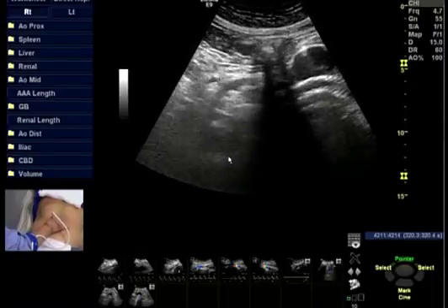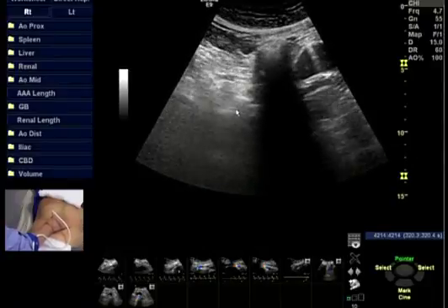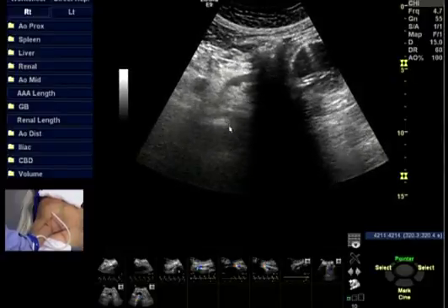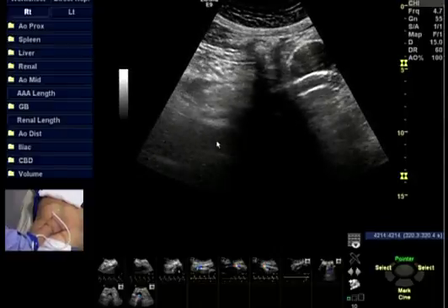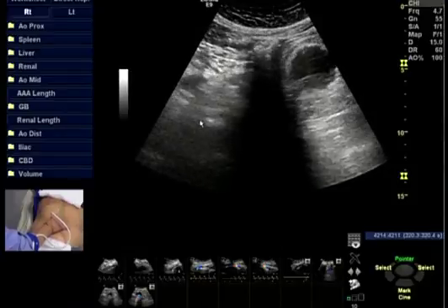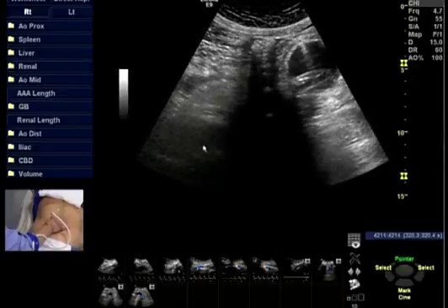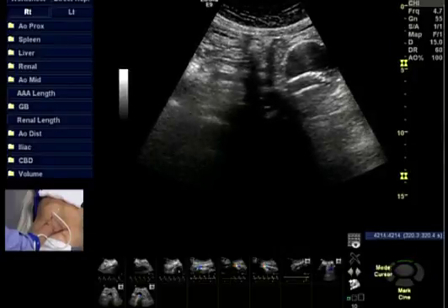Again, our friend, the local gas bubble. You can see the continuation of the aorta above that, and follow the proximal aorta up towards the diaphragm, the superior mesenteric artery coming up, the abdominal aorta down here. And you can see, again, as is typical of an endograft patient, because you put a fairly rigid graft inside a native vessel, it will take some sharp turns and twists as you go. So do not be surprised by that. The native aorta here, the endograft ending up here.